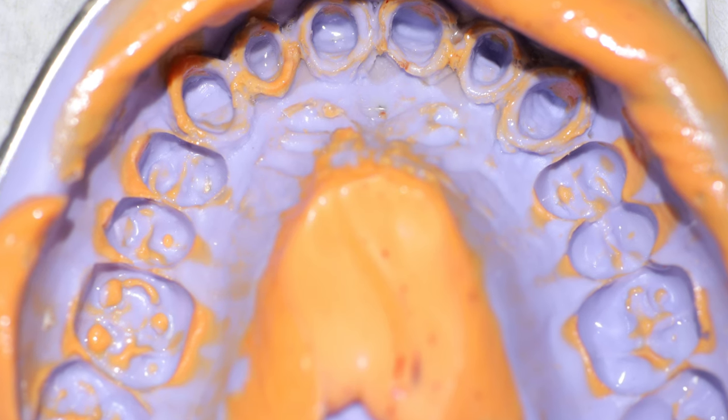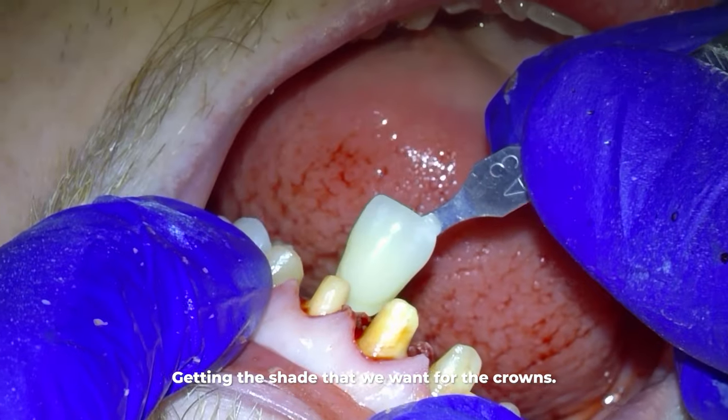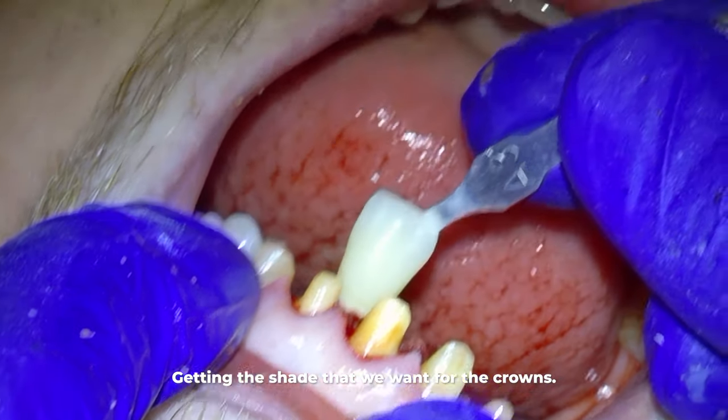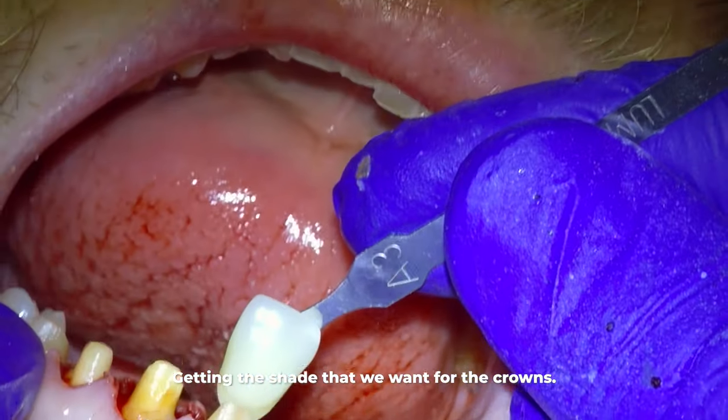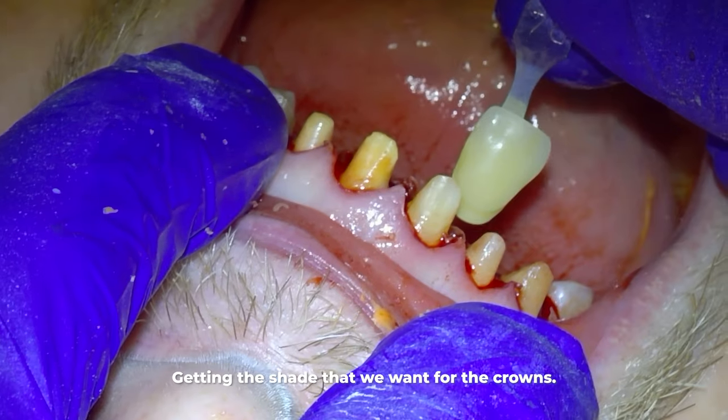You have some leeway — the crowns don't have to be the same shade as all of the other teeth when you're doing the front six. If you're just doing one tooth, they have to be the same as the other teeth right around them.